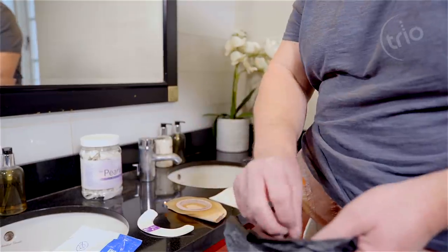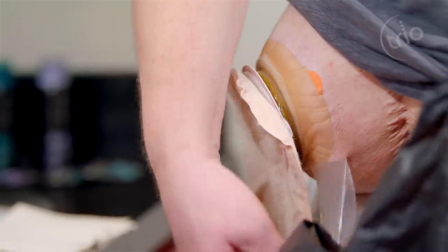Simply remove your old flange extenders. Trio Silics removes in one piece, leaving no residue.